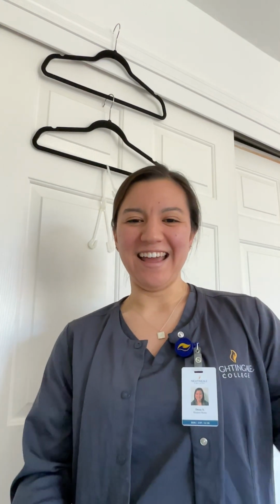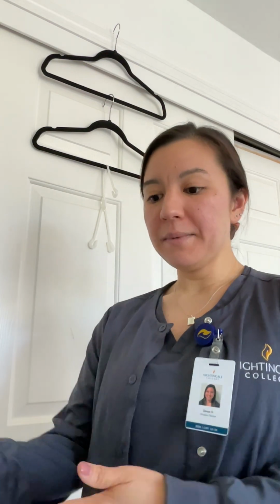I'm going to go ahead and ask if there are any allergies to medications. If there is or not, I'm going to verify that in the patient's chart. So I'm going to go ahead and start. I'm going to perform hand hygiene, and then I'm going to put my gloves on.